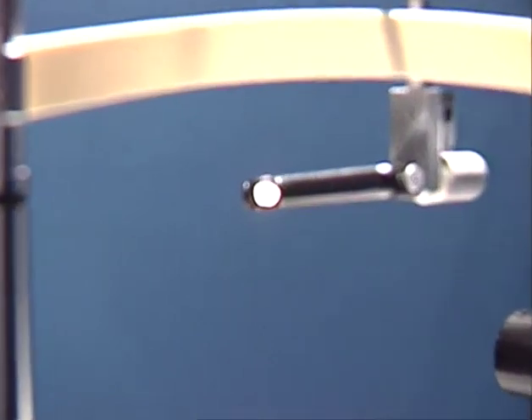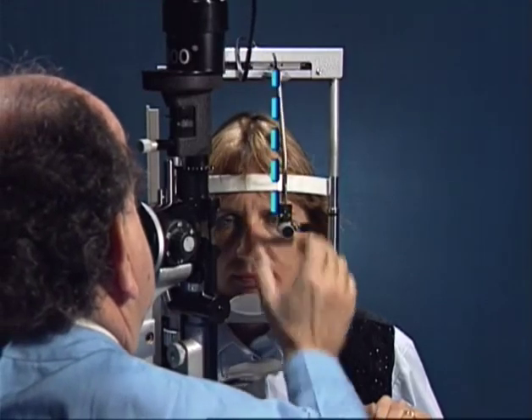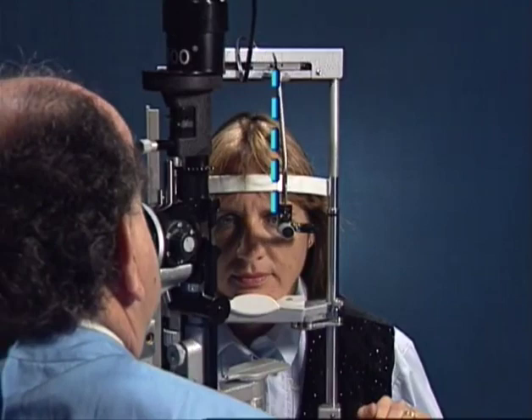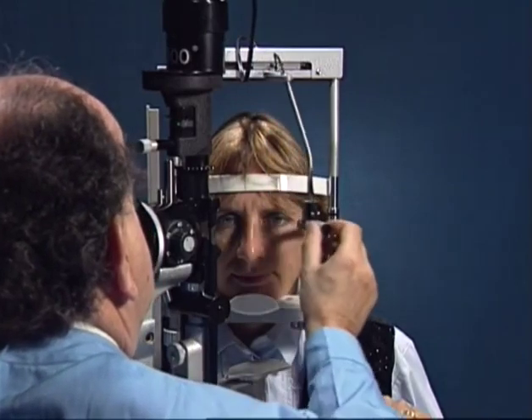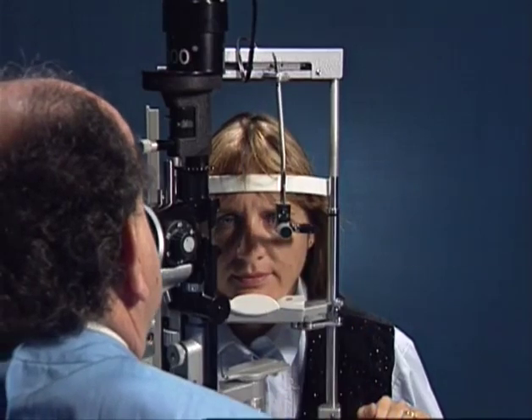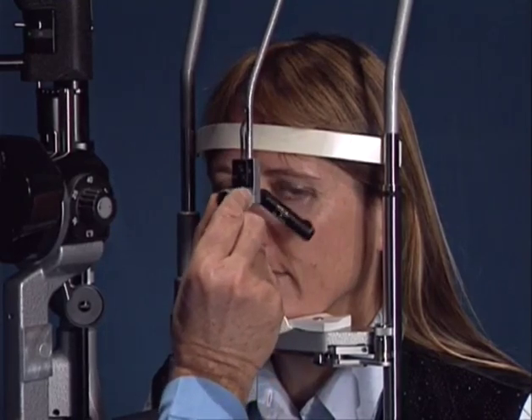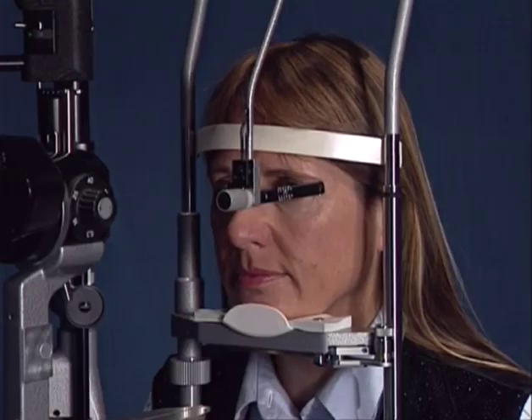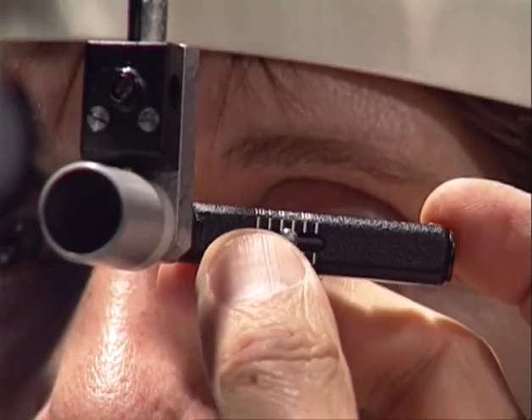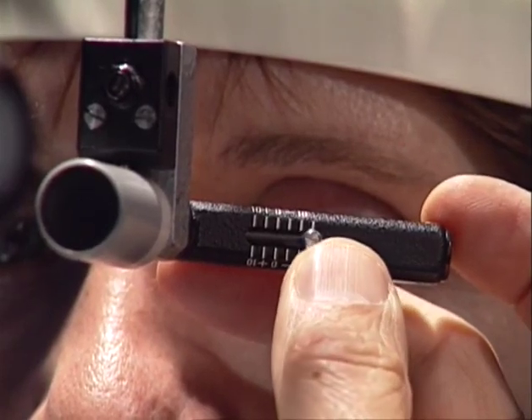This is the fixation device with the illuminated fixation target. Its starting position is reached when the prolongation of the vertical axis passes right in front of the patient's cornea. Then the patient's eye can be guided to the right and left by shifting about the vertical axis, and in all other directions by rotating the target around the horizontal axis. And this is the sliding lever for setting the illuminated target to the patient's refraction and thus preventing accommodation.